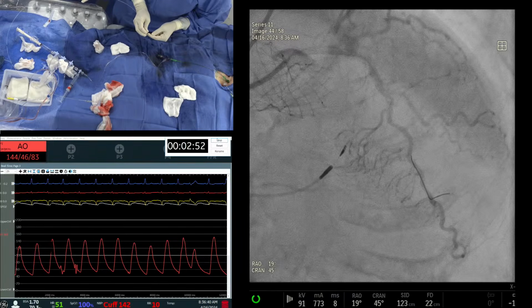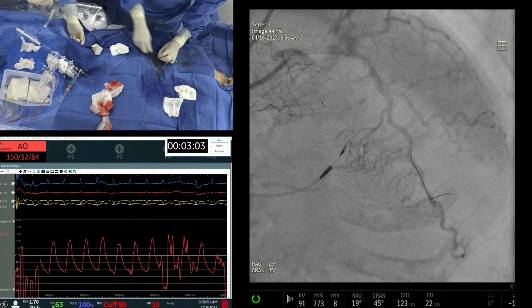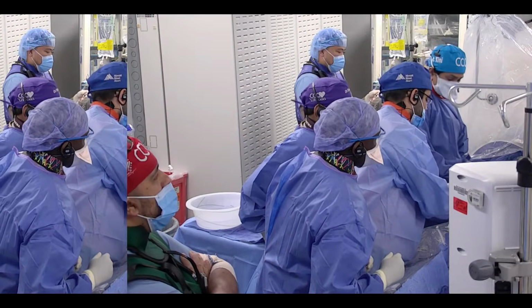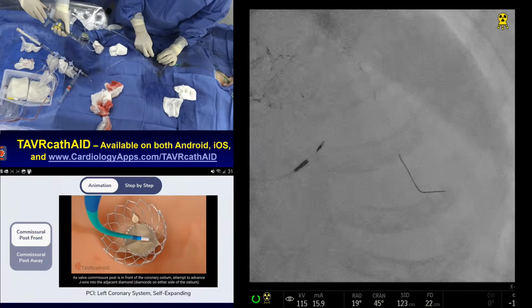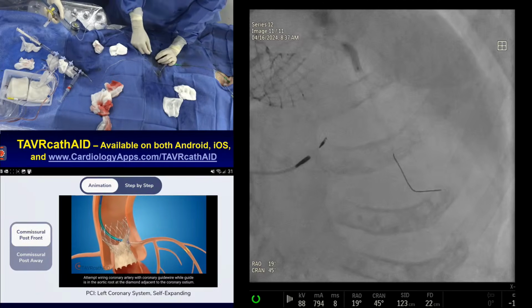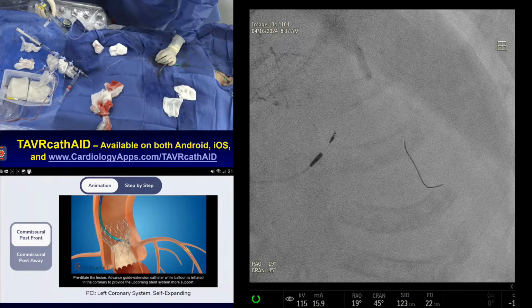Now we go back to the PCI animation where we have the bird's eye view. Good. Okay, go up. 16, 18. 20, no? Okay, down. I'll go a little bit inside. Yeah, and that's it. Done. Yeah. Go here. 12. Okay, no more. Don't go. Okay. Down. Okay, animation is ready. Okay, let's go full screen.